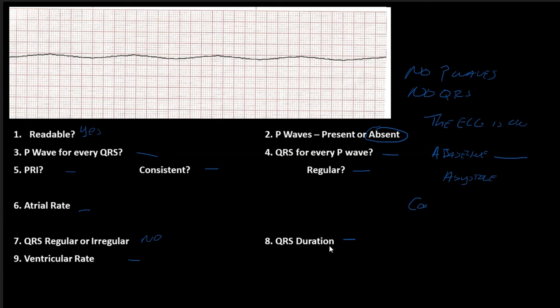You need to confirm this in 2 leads, and always check your patient. You always need to check your patient, particularly with anything like this, before you start doing a whole lot. Make sure that they are pulseless and apneic.